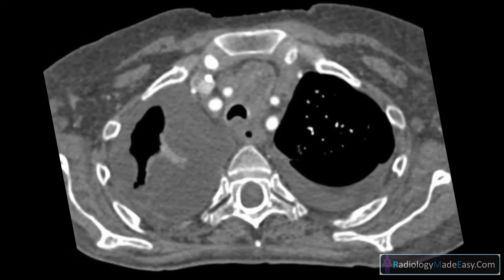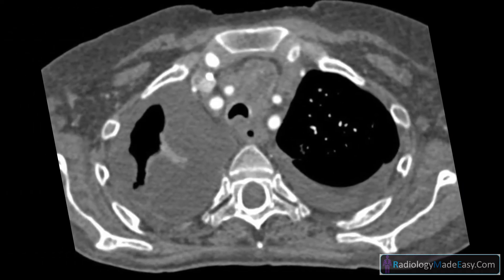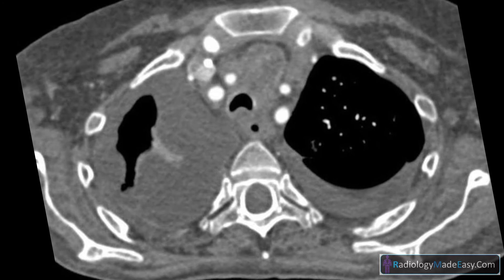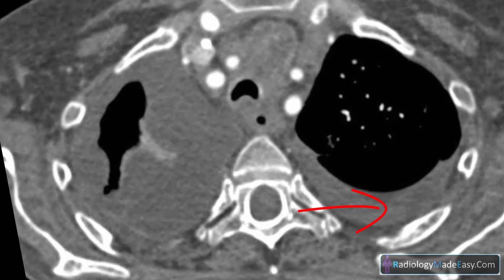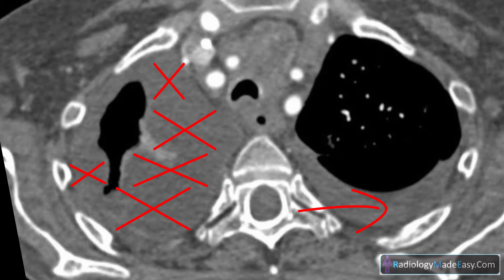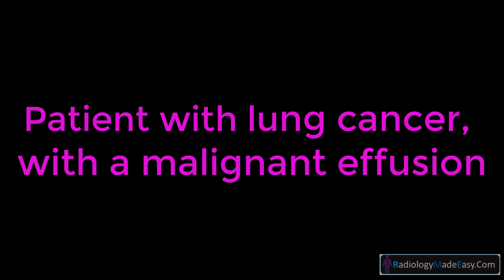These images show bilateral pleural effusion with right-sided loculated pleural effusion. This is a patient with lung cancer with a malignant effusion.